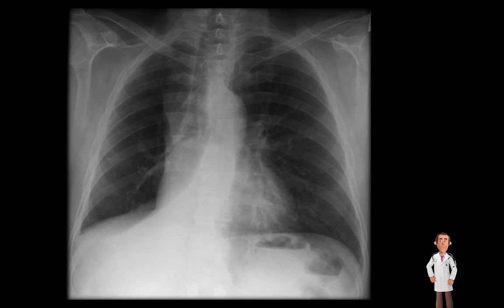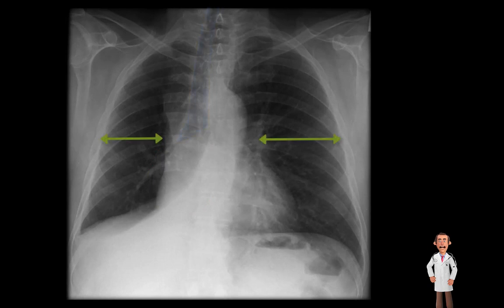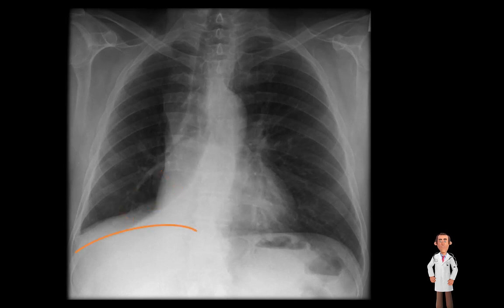Case one. What's immediately obvious is that there is an abnormality in the right lung field. Moving on to our systematic approach: the airway is deviated towards the side of the abnormality. The lung fields are asymmetrical with a size reduction in the right lung compared to the left. In addition there is a triangular opacity in the right lower lung with absent lung markings. The outline of the right hemidiaphragm is completely obliterated and the right heart border and mediastinum are shifted towards the right.